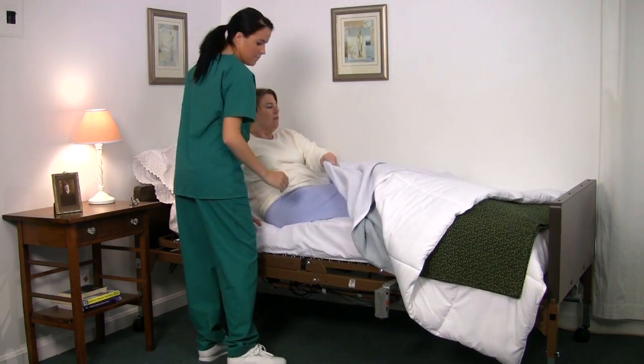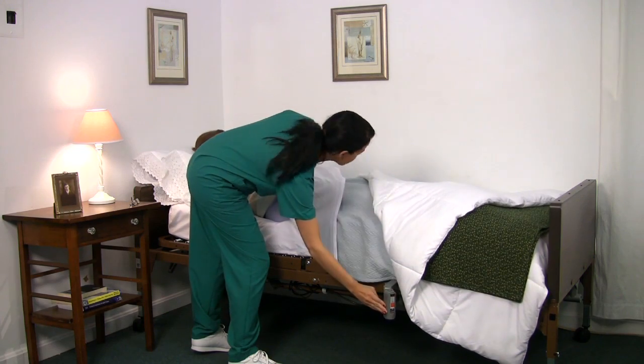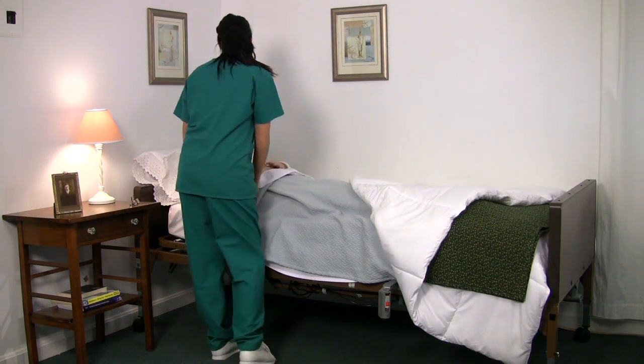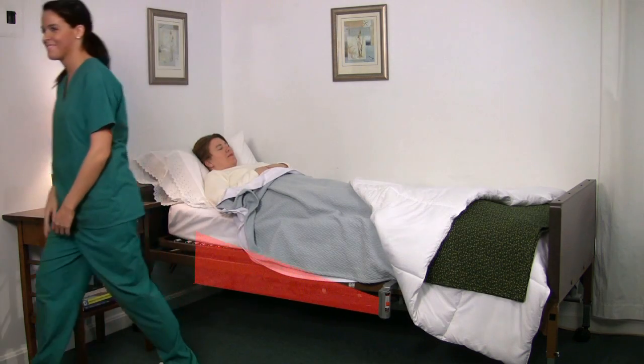With the unit mounted in the specified area and patient in place, turn the device on. Remember you have either 10 or 20 seconds before the alarm activates in case you need to cross the sensing field.